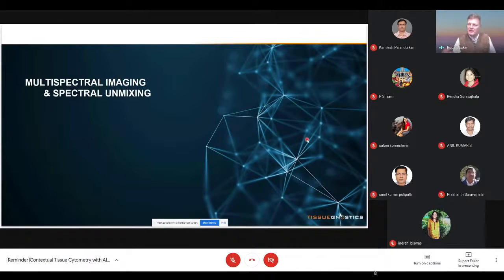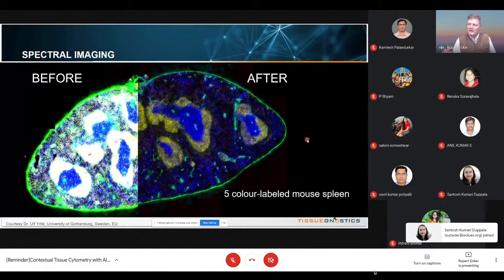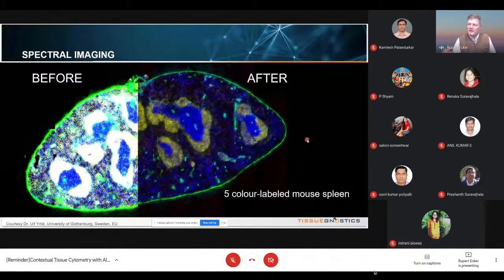In multispectral imaging, all markers, up to 10, are applied at the same time and acquired by specific acquisition technology, which includes a liquid crystal tunable filter that allows us to detect a lambda stack. When we talked at the beginning of this presentation about a confocal microscope, we talked about the Z-stack, where you look at a given sample, a given region, in different focus positions.